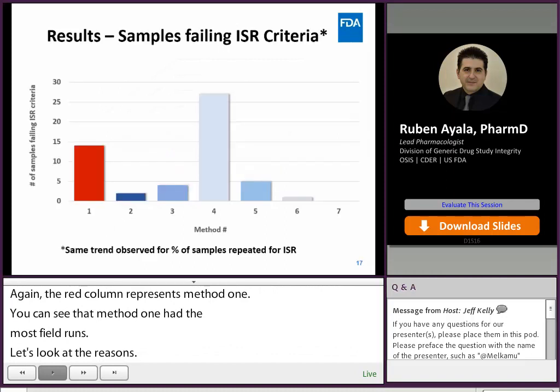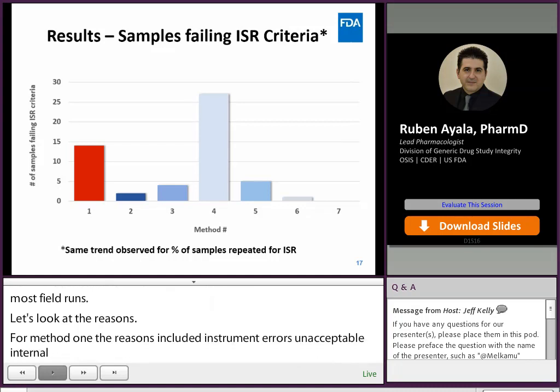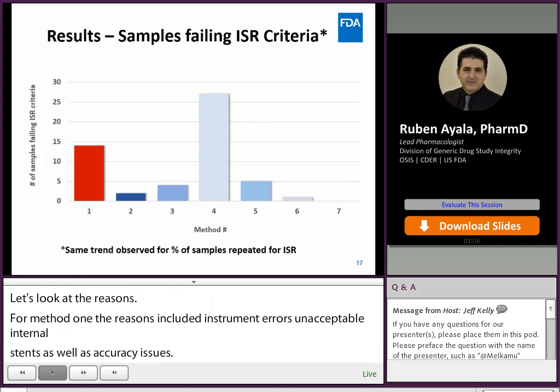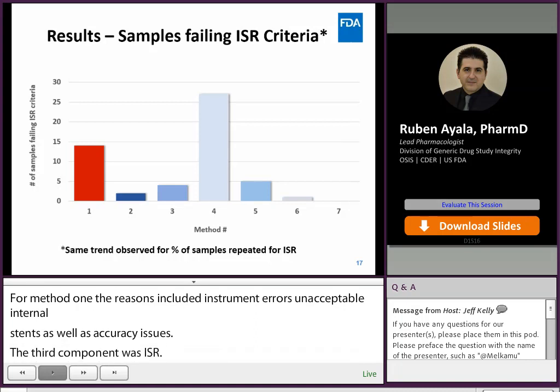The third component was ISR. The red bar is method one. Based on the count shown on the y-axis, method one had the second highest number of ISR samples that failed the acceptance criteria. However, it's worth mentioning that all the methods met the overall incurred sample reanalysis criteria as specified in the FDA guidance document.